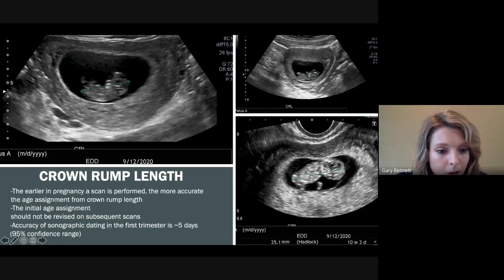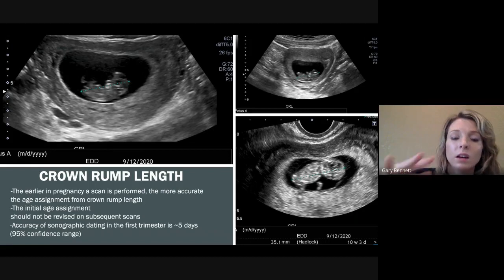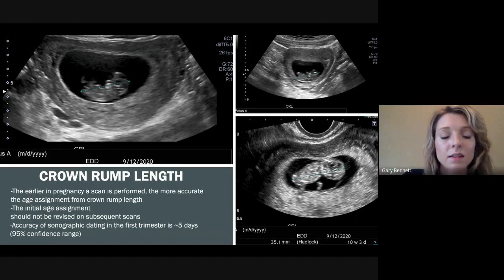Let's see what else we have on here. Yeah, basically this is just all touching on the significance of this measurement and the accuracy that it provides. So super important there. It's really nice, especially again, as baby progresses, we want to make sure that they're sticking around the sizes and dates that we see at this early stage.